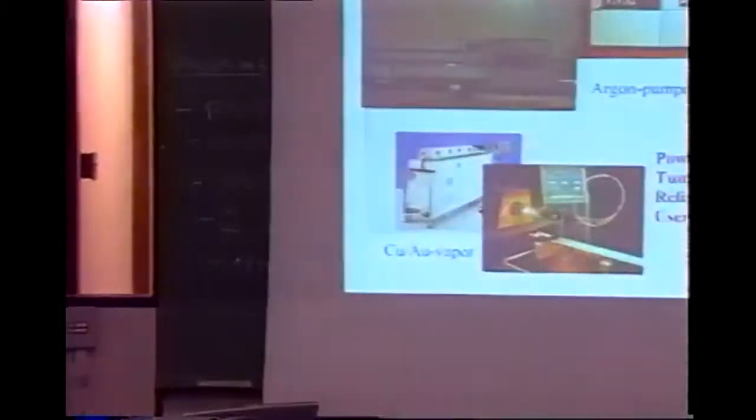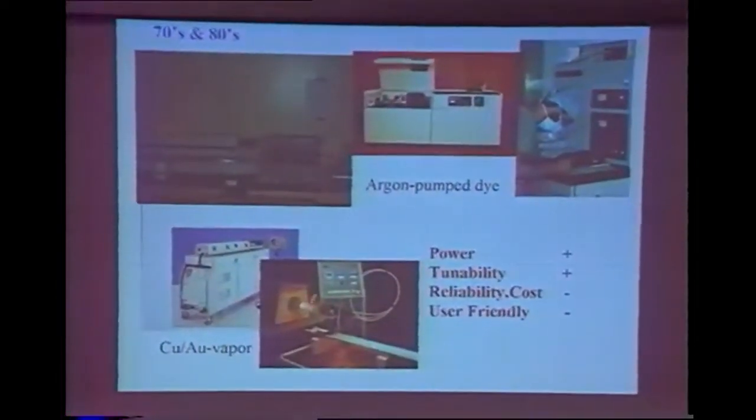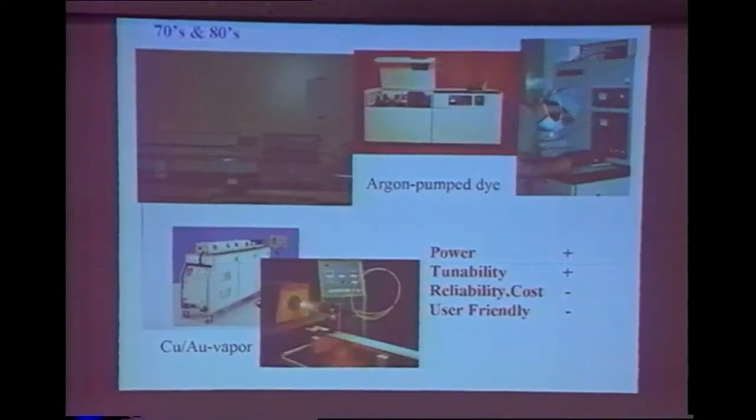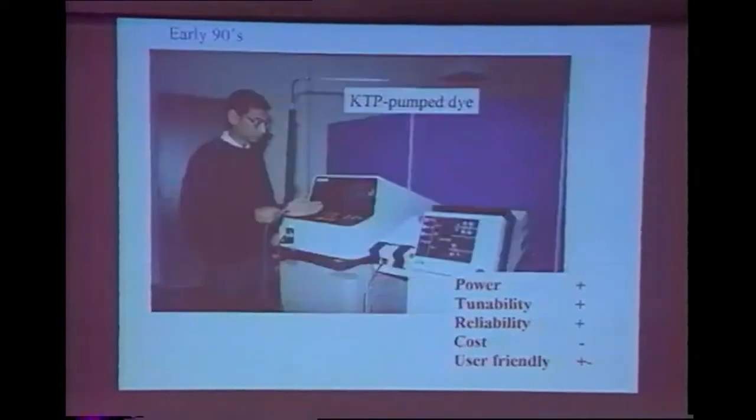Very high power, but a big beam. People were able, without doing any collimation, to deliver light into multiple fibers simultaneously. They were very popular in Australia. There's a company in Australia that did these, and a company in England, but they're very large, more reliable than this, but still difficult technology.